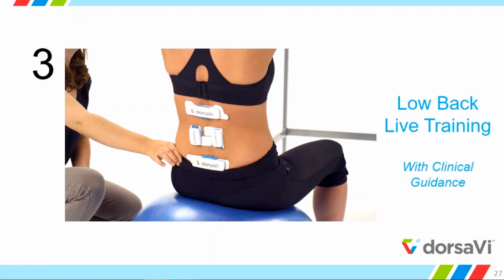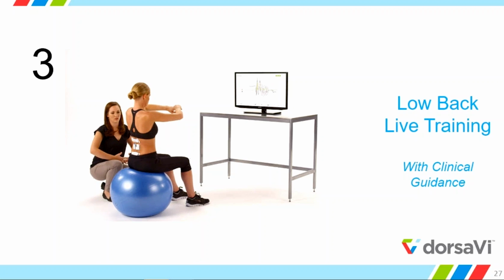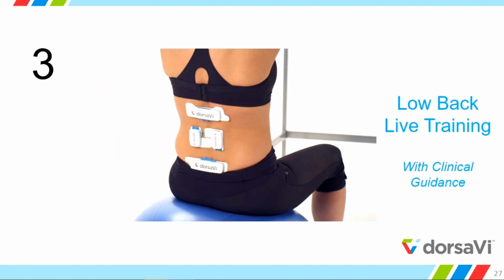So what you can see here is obviously she has the sensors on, including the EMG sensors, and the patient is watching the balls on the screen. You can see up on the screen to the left are some balls that are depicting the sensors and also the low back movement. They'll come into play in a second.